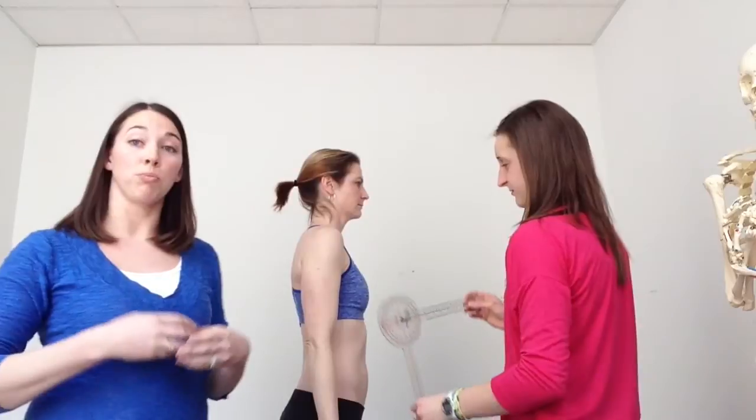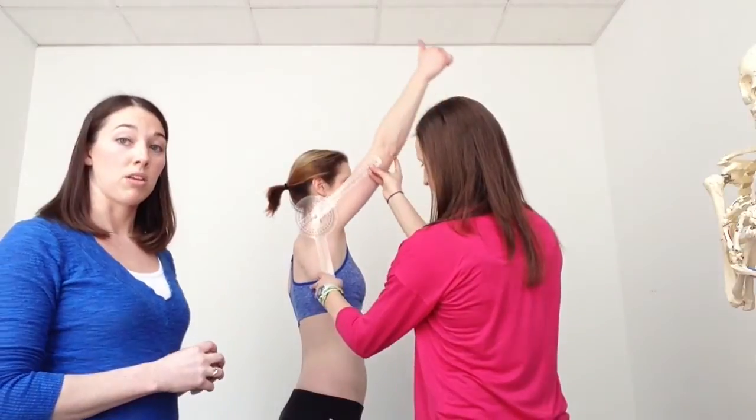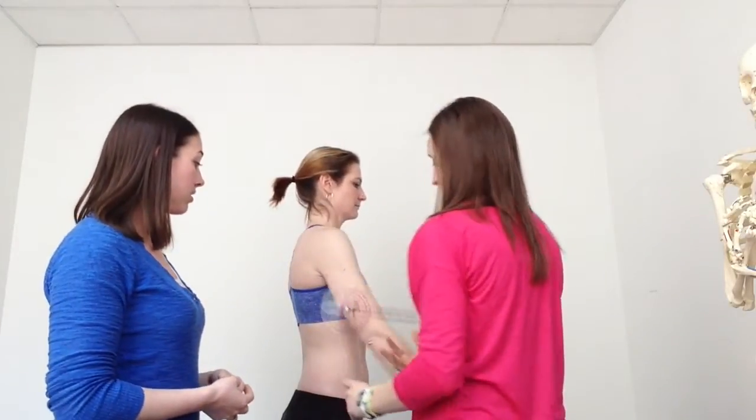And next you'll do passive range of motion. So you will move the patient's limb for them and take another measurement here and then relax. Good. So normal shoulder range of motion for flexion is 0 to 180 degrees. It's typical to have 5 degrees of difference between your active and passive range of motion.